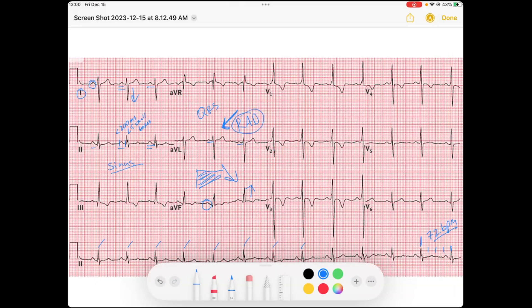When I see right axis deviation, I should ask what can cause it. Common causes might be right ventricular hypertrophy, bundle branch block, anything that causes right heart strain, or it could just be anatomy — such as situs inversus with dextrocardia, which is when the heart is on the right side. Let's evaluate for right ventricular hypertrophy.